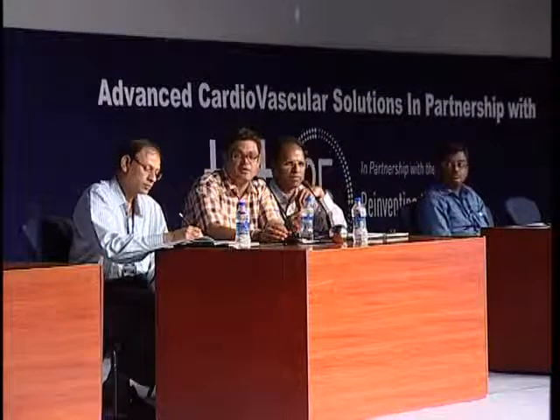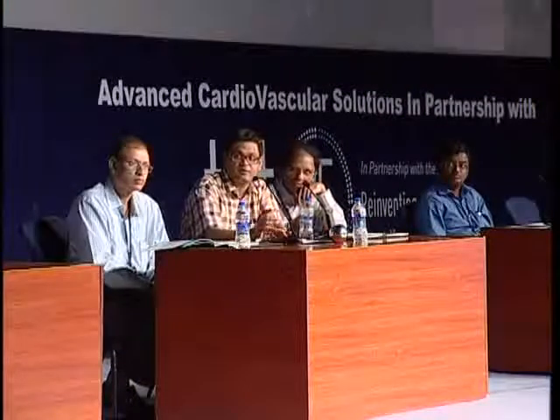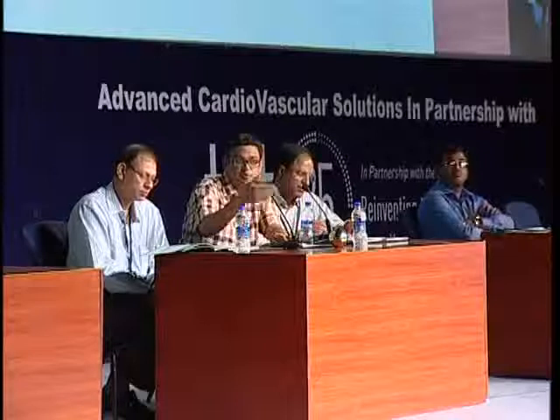So, good case, but when there is stent migration, as you rightly said, that just shows that the stent was not properly deployed. It was undersized, and that happens very frequently when you have a thrombus there, because that can also lead to spasm, and many times you wrongly assess the size of the vessel. That is why people are now advocating self-expanding stents in these situations.